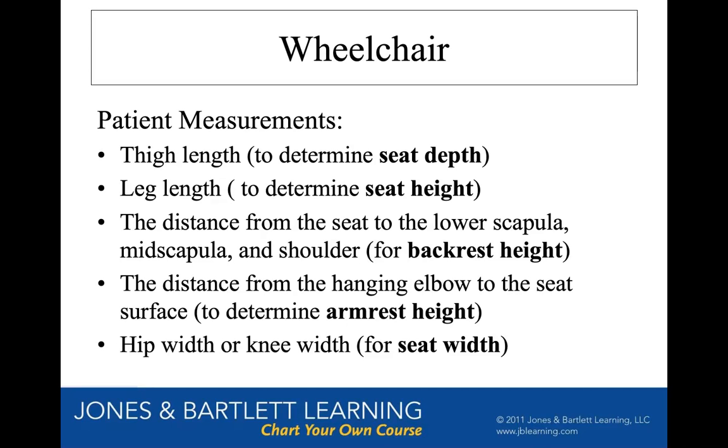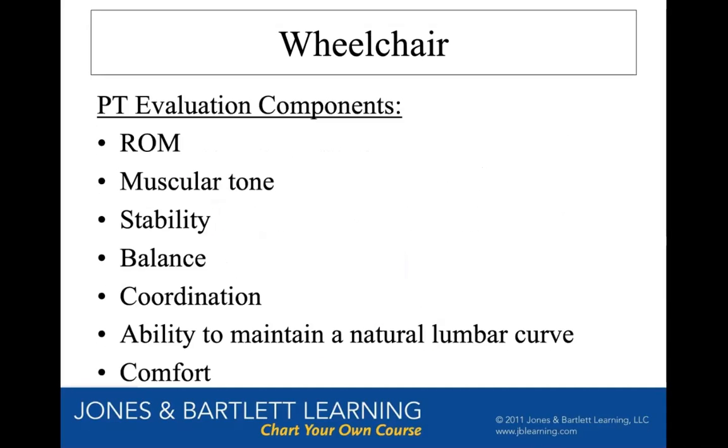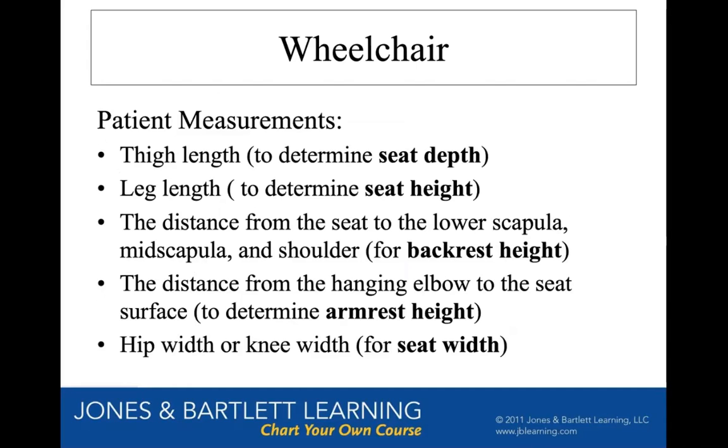So whenever somebody is getting a wheelchair, if they're going to be a wheelchair user for the majority of their mobility, they need a customized chair. They're not going to be using these little off-the-shelf chairs that I just showed you. People that are wheelchair users primarily for their mobility are going to have custom chairs. So that's why we're measuring all of these things, to get their chair custom just for them.